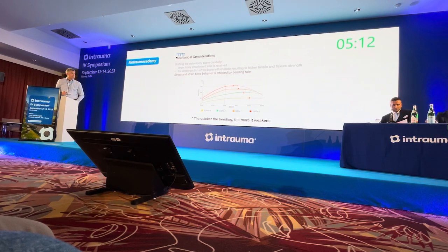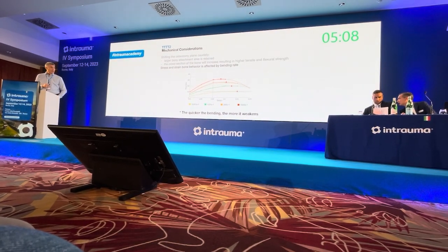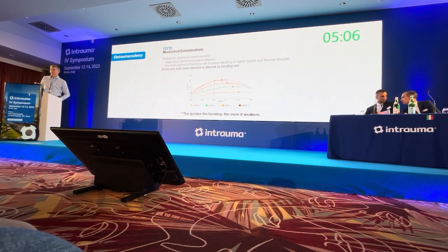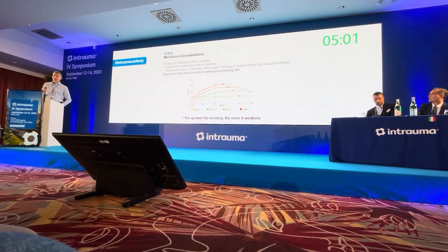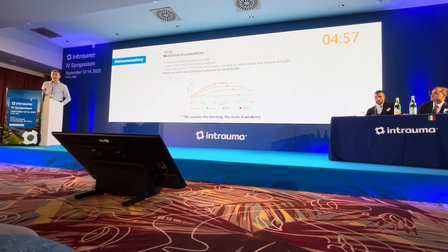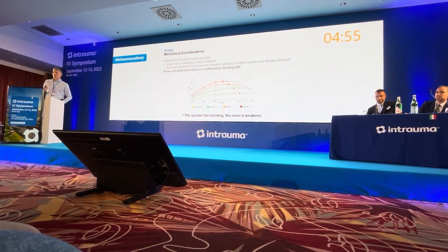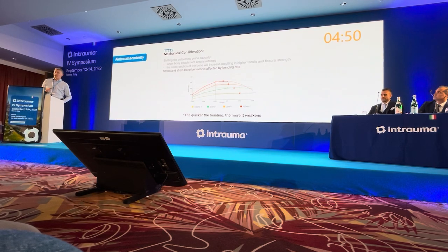Also critical is that the stress and strain on bone behavior is affected by the bending rate. And so the quicker the bending, the more the bone weakens. Thus the importance of following carefully the technique, and this set speed has been designed very carefully to allow for the viscoelastic bone to bend and adapt without going past a breaking point.